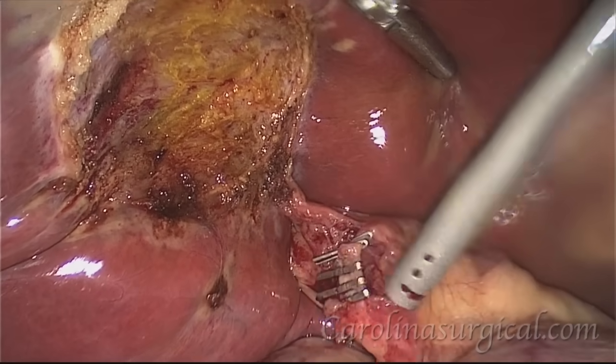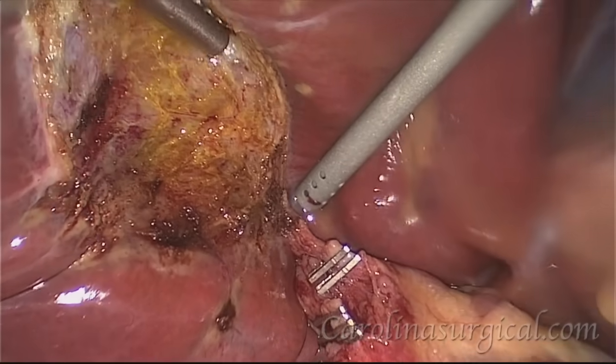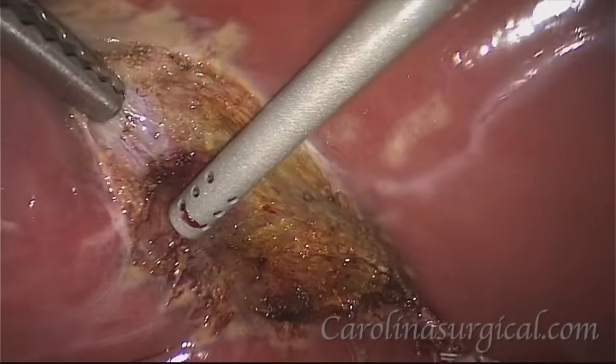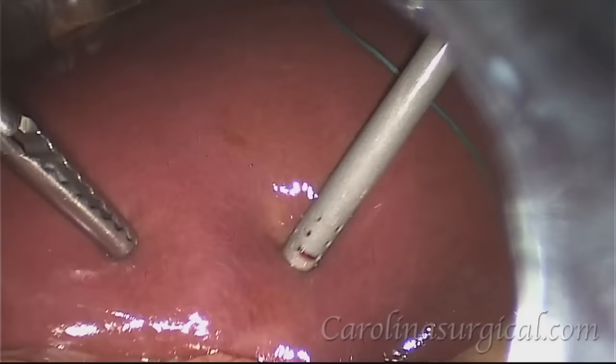We can see that our cystic duct is adequately clipped and there's nothing leaking from it. You can see the cystic artery is also very well clipped and there's no bleeding coming from there. There's also no bleeding from the liver, so now we're ready to take out the gallbladder.